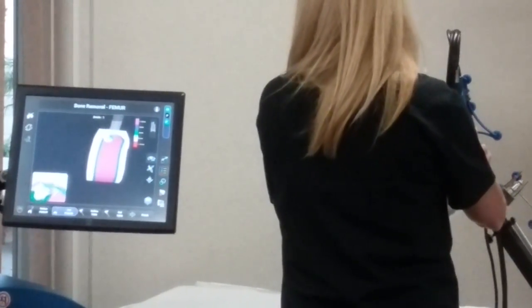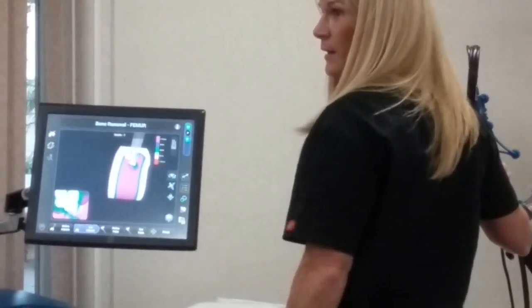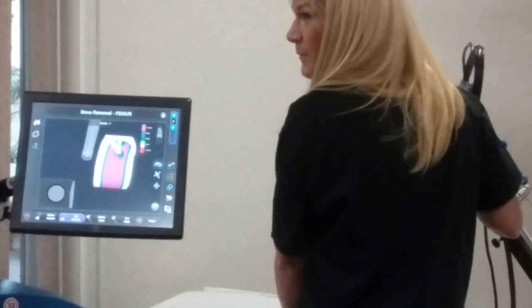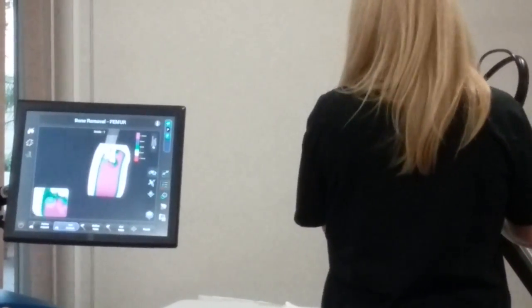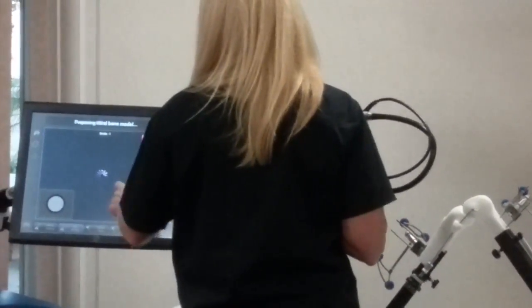And then basically, you'll see in this picture here, that when I'm on my white, which is my target depth, it retracts up and it won't let me cut anymore. So the surgeon cannot cut any more than he's supposed to cut. If I get out of the zone, it won't let me cut either. My foot's still on the machine. Great. So we go through and we do all that. We'll just burr it all out. It'll take a bunch of time, so we'll save you guys some time here.